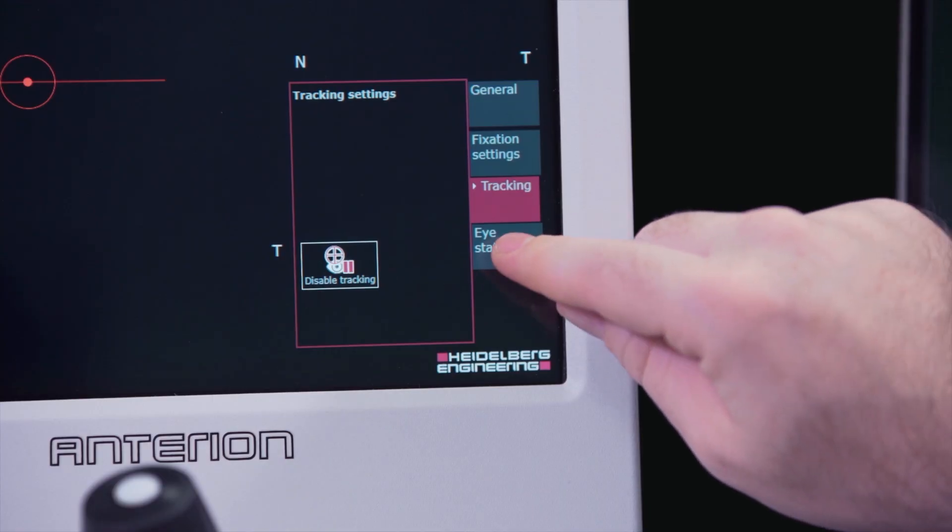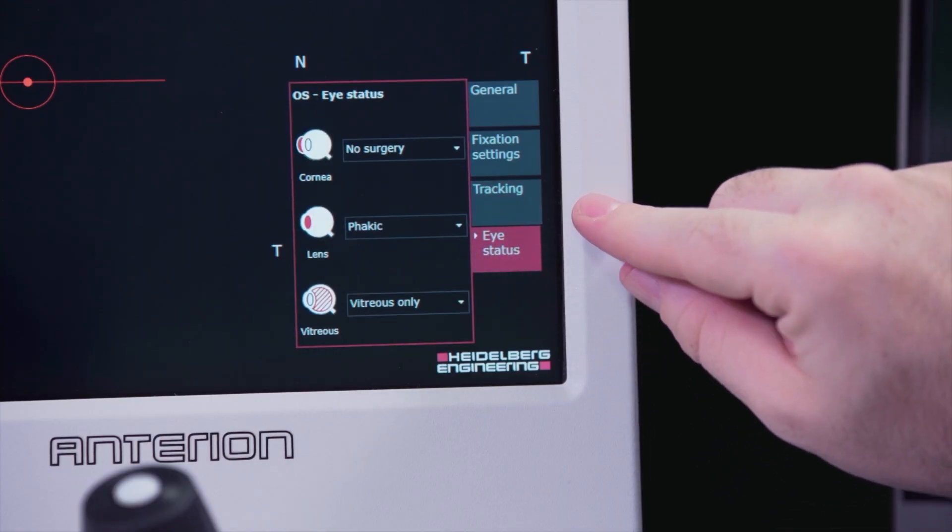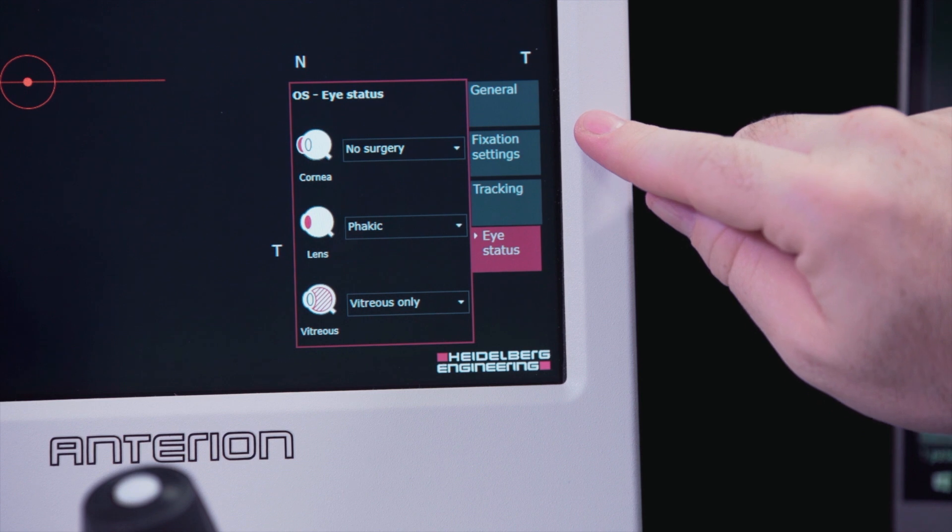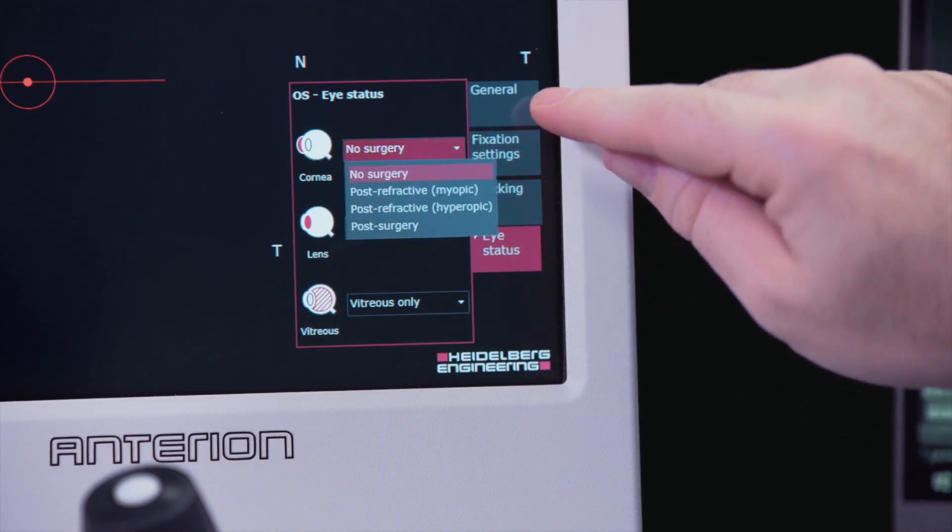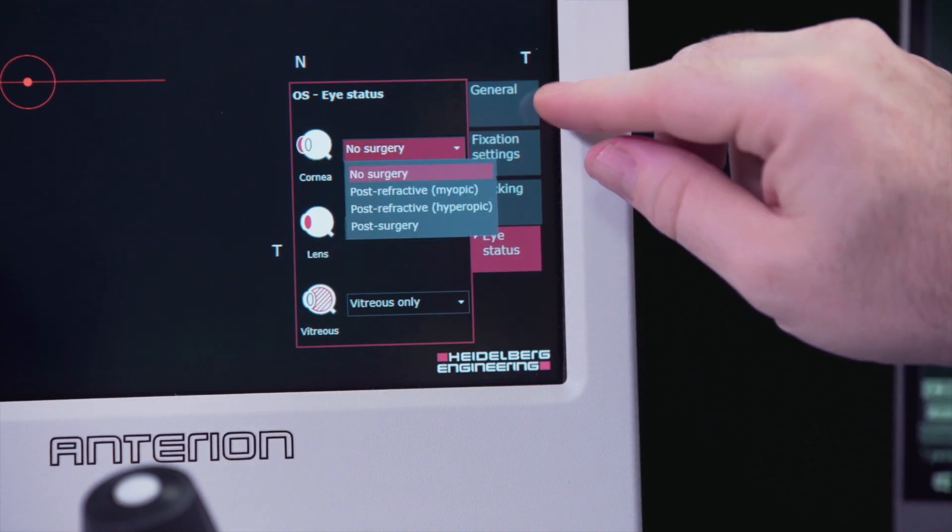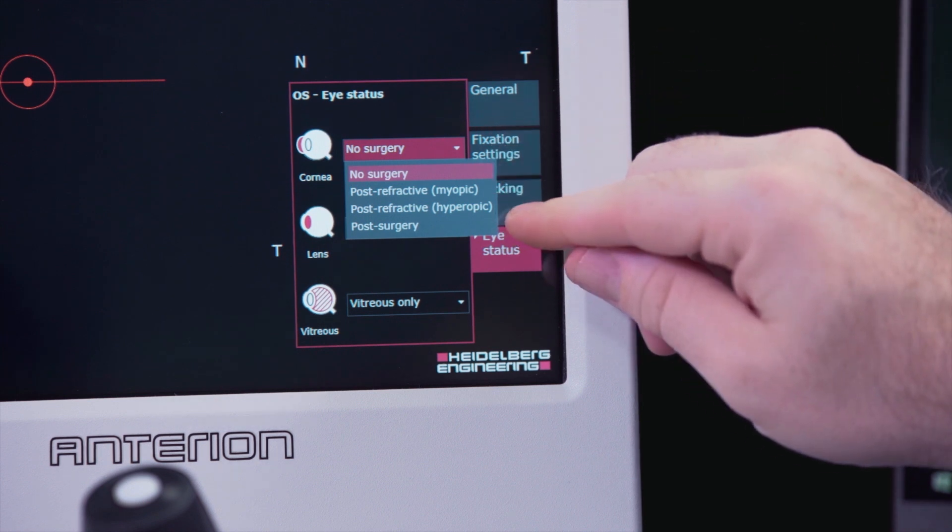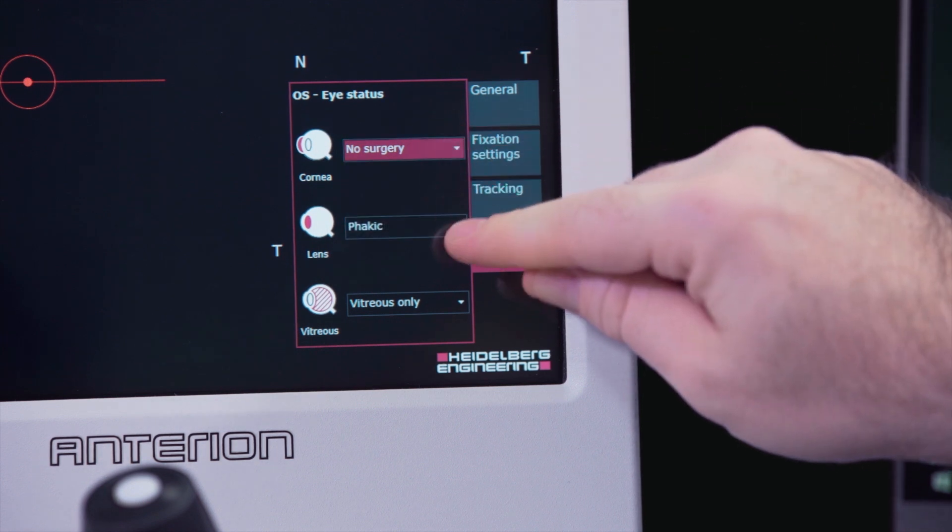Choose the cataract app from the touch screen. The eye status tab allows you to record surgery on the cornea, lens, or vitreous. This can be done post-capture or when adding a new patient in the software prior to acquisition.